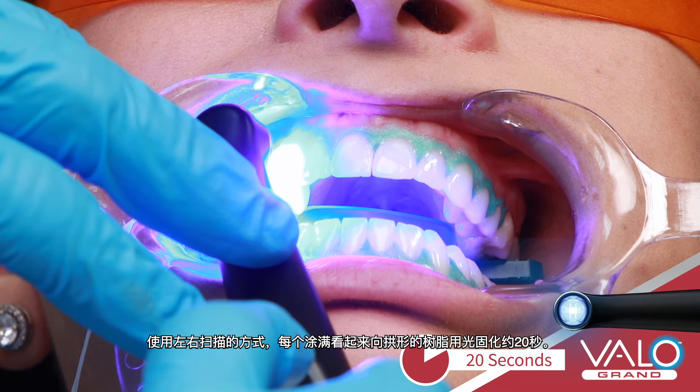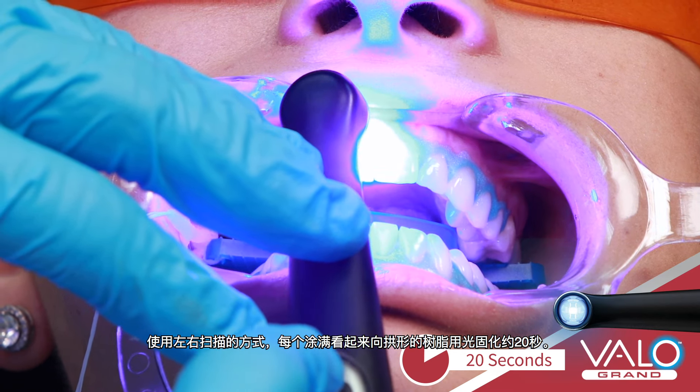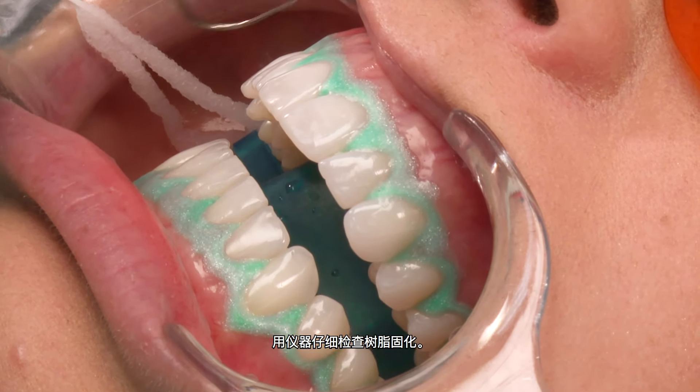Light cure the resin for 20 seconds per arch using a scanning motion. Carefully check the resin cure with an instrument.